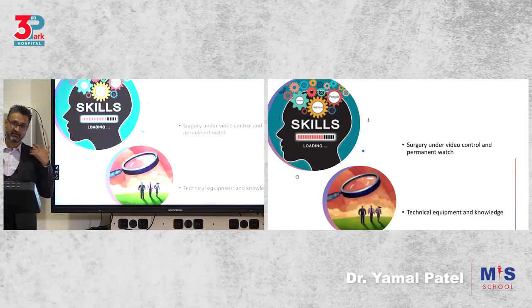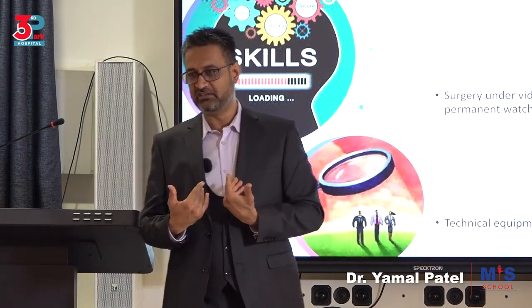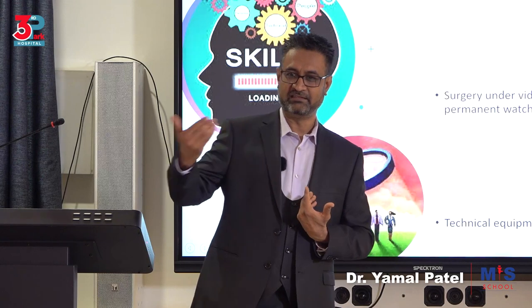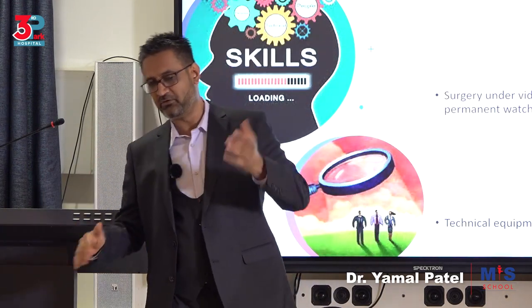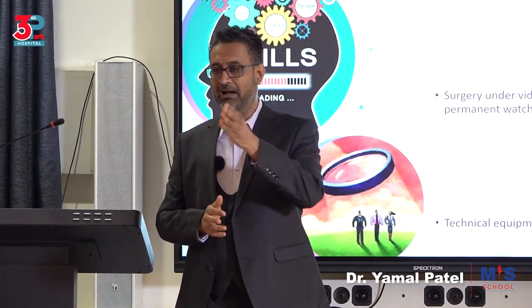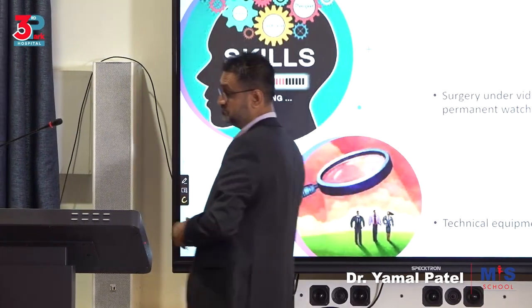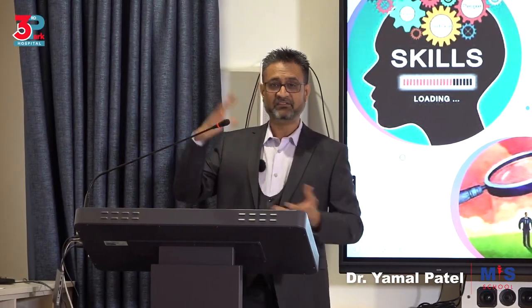You need technical equipment knowledge. Laparoscopy is not only learning how to do the surgery. It's also learning the technology around the surgery. So in regards to anesthesia, what are the effects that we're going to get because of whatever we're going to ask for in Trendelenburg position, what are the changes we're going to get, how do we work with energy, how do we work with the video and the insufflation, etc. So you need to know this technology.